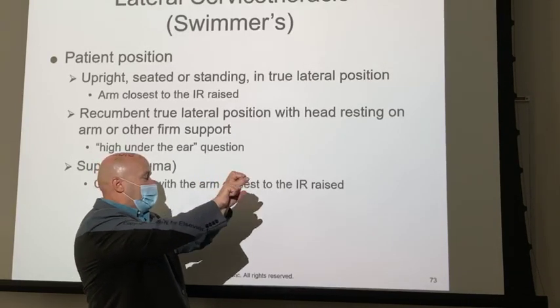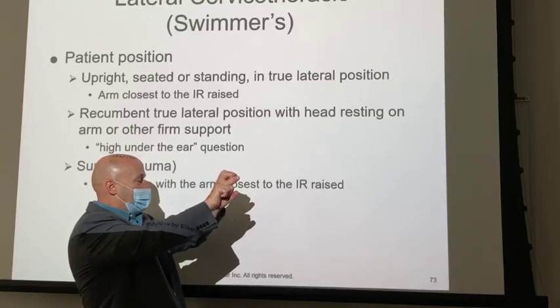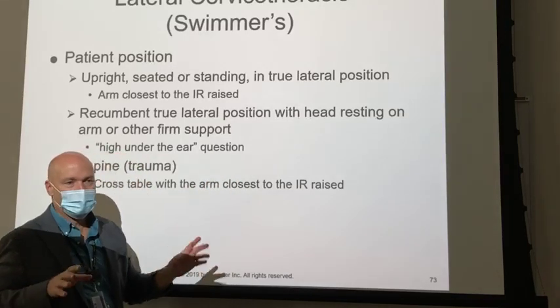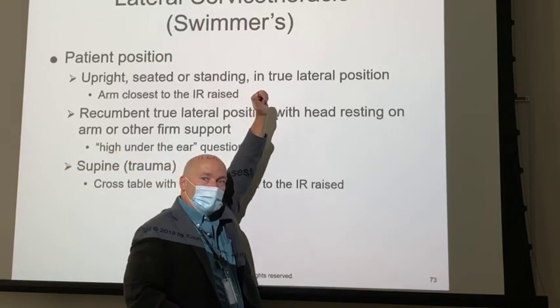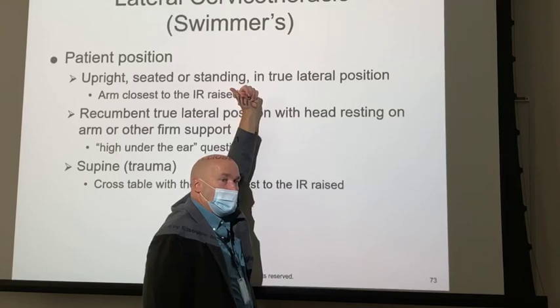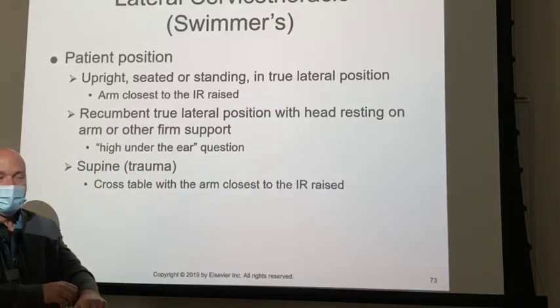Okay? Still though, what you have in a lot of cases is you've got separation of the shoulders, but you still can't see it very well. So what I'll do sometimes, this isn't in the textbook, this is just free, is I'll have a patient get their arm up, this arm down as far as possible, and then I'll oblique them just a little bit. And I'm talking about maybe a 5-degree oblique.